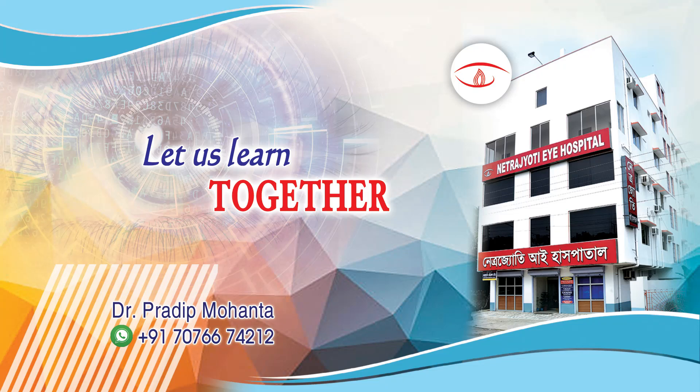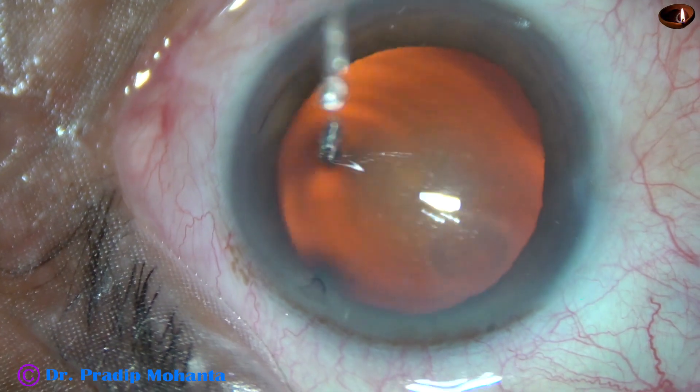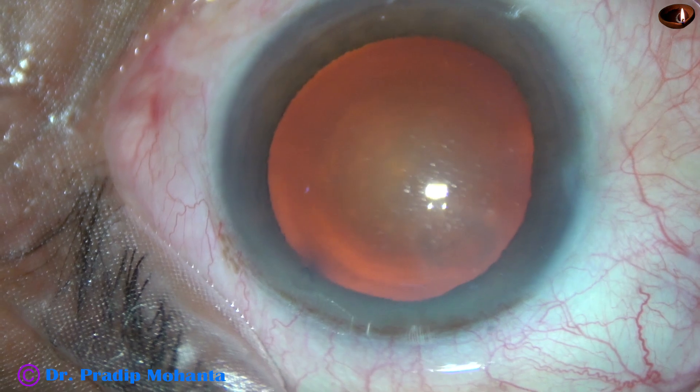Friends, welcome to my workplace at Rana Ghat, West Bengal, India. This is a cataract with grade 4 nuclear sclerosis. Let us observe this surgery.